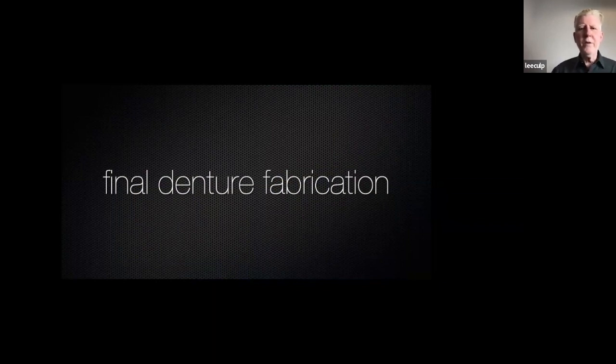Now, digital dentures are really easy to make changes if you get the bite right. This is important to know. If you get the bite right and go, Lee, it's canted, or I want to do this, or the patient would like her laterals twisted, or whatever, it's so easy to do. Open up the file. I can change vertical. I can open it, I can shut it. I can make the teeth longer. Do anything you want if the bite's right. If the bite's wrong, we basically start over.